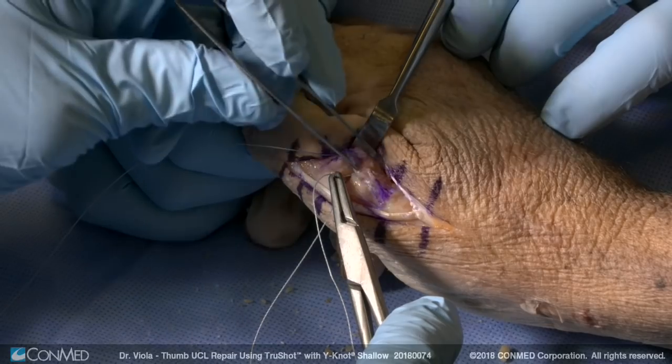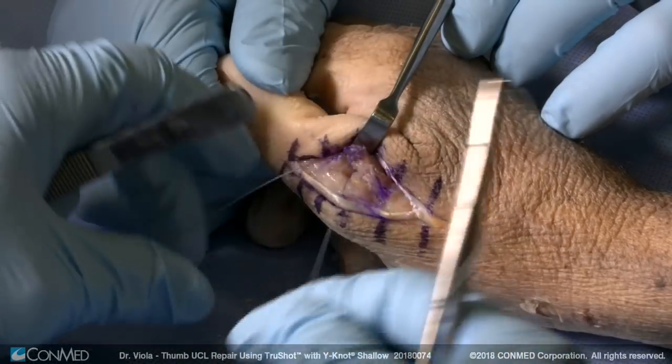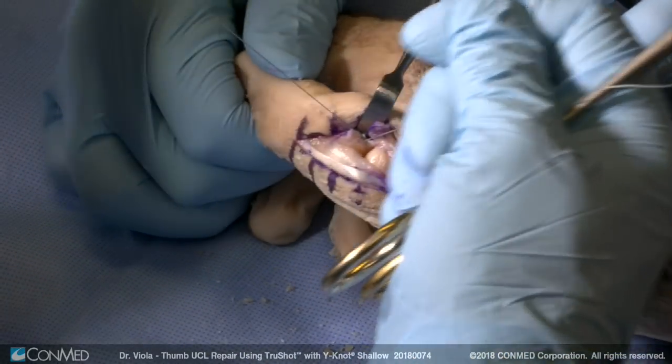The device is all suture. The suture is a 2-0 hi-fi high-strength suture. The suture slides.